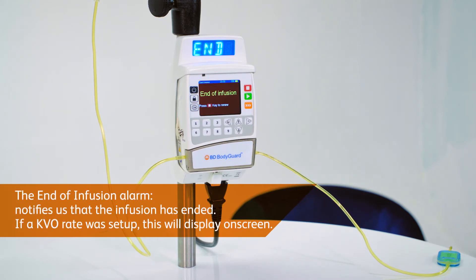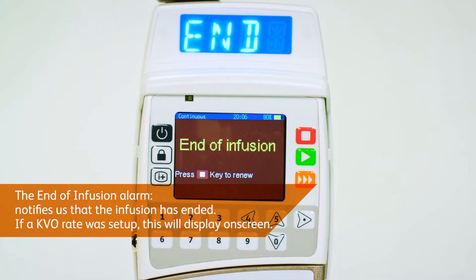The end of infusion alarm notifies us that the infusion has ended. If a KVO rate was added during setup, this will display on screen.